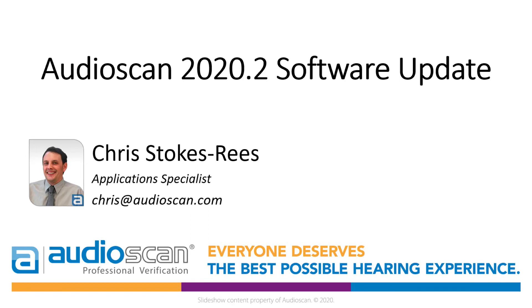Hi, today we're going to quickly cover a few key features we have added in the AudioScan 2020.2 software release. The changes for this one are primarily for the Verifit 2 and the NOAA module, although we encourage you to update all your AudioScan equipment to the latest software.